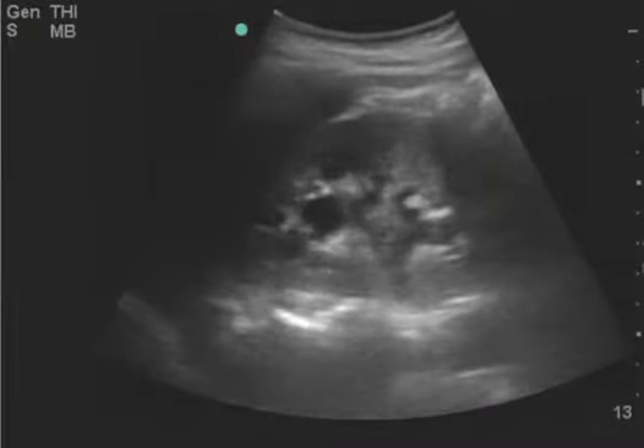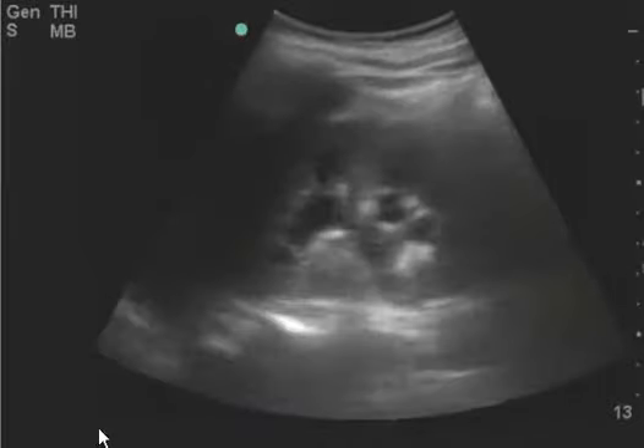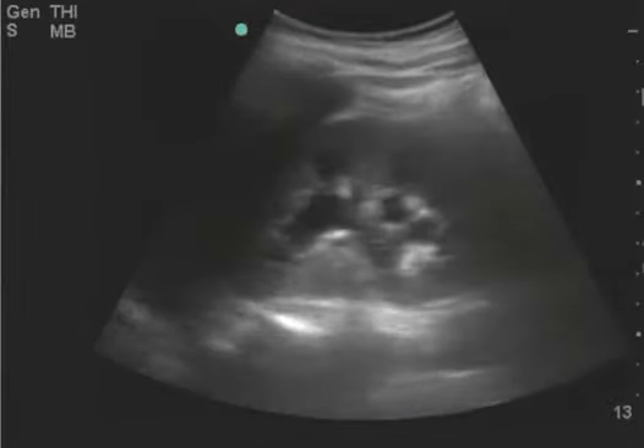This is a renal ultrasound and most likely this is indeed positive for hydro. It would have just been helpful to have put color flow here to make sure this is the collecting system and not an artery or a vein.